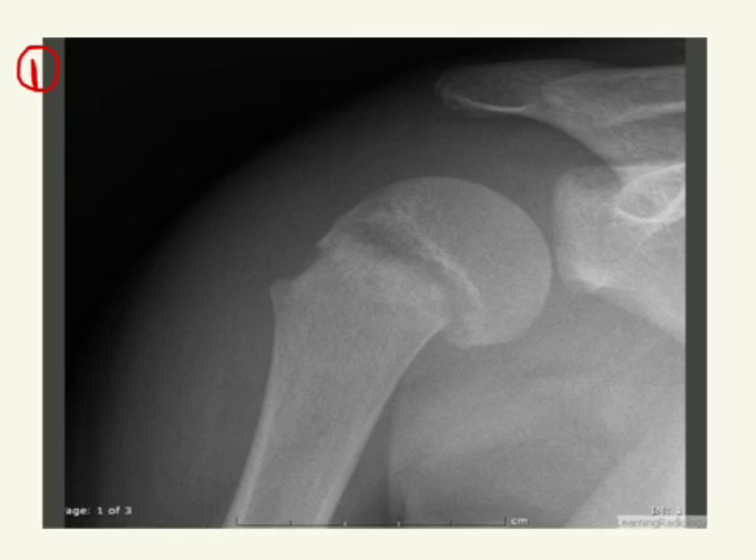So in this video, here is the metaphysis, here is the epiphysis, and here is the physis. You can see that this is kind of slid off, so there's increased space here, and it's displaced some. So this would be a Salter-Harris type 1.